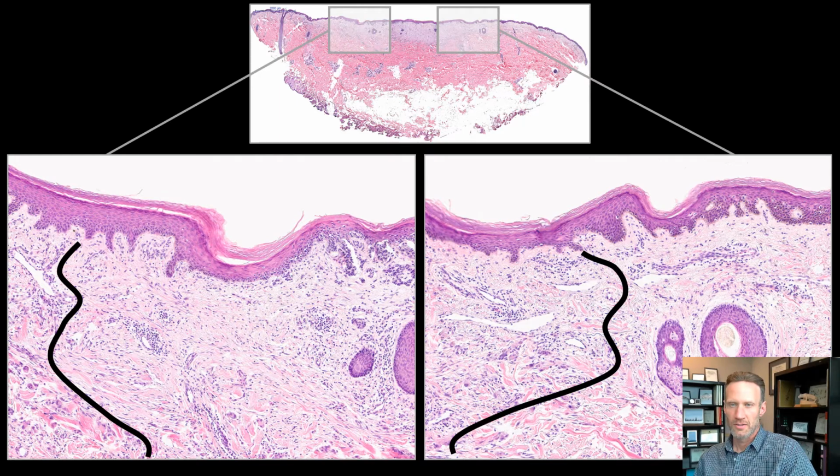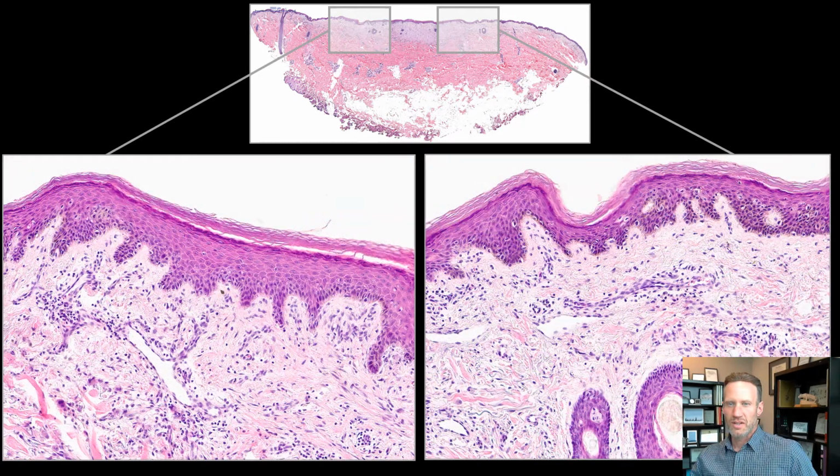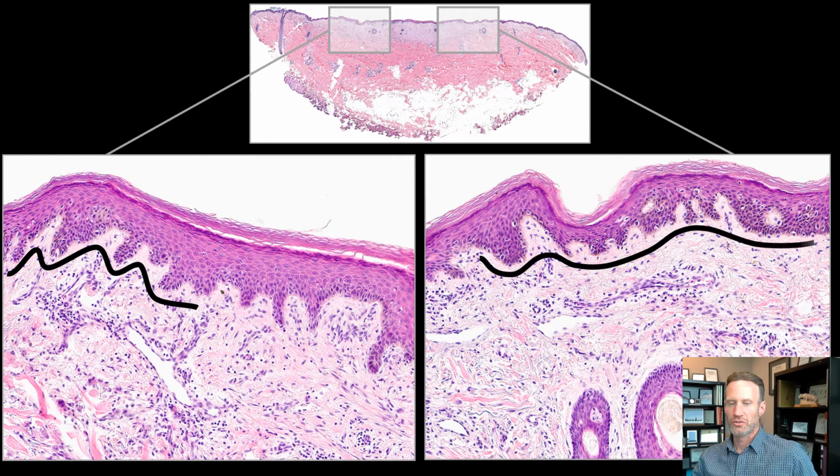at first glance. And I say at first glance because at higher magnification, the epidermis peripheral to both the right and left sides of the scar does contain at least a few conspicuous melanocytes, which are also arguably increased in number as well.